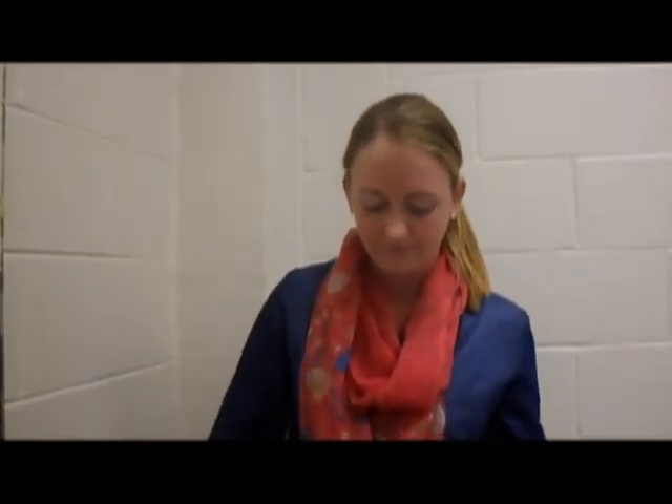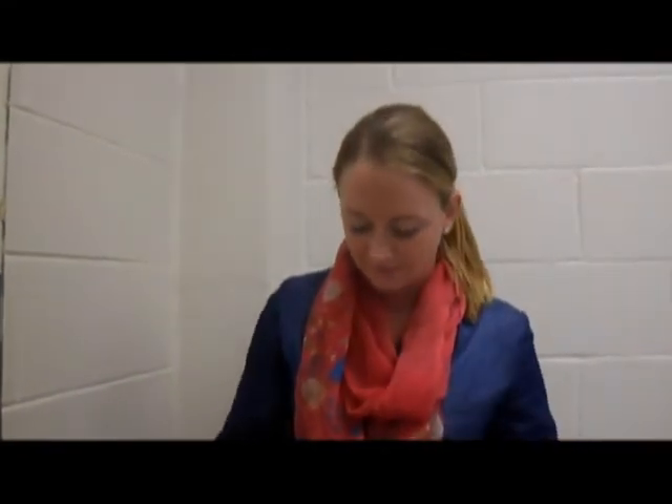Lauren is now applying her makeup by utilizing tenodesis. The same technique can be used to complete grooming tasks such as shaving, brushing your teeth, and brushing your hair.